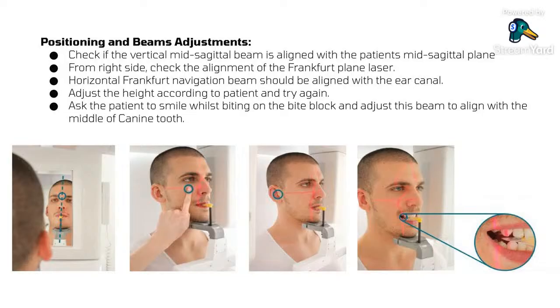Okay. Now I told you, if the patient is tall, you may want the patient to sit on a stool without a backrest. Or if there is a child who is really short in height and the machine just does not get there, you would give them a stool so that they can stand higher. What if there is a patient who is in a wheelchair? So you will make sure that the wheels do not collide with the machine base.